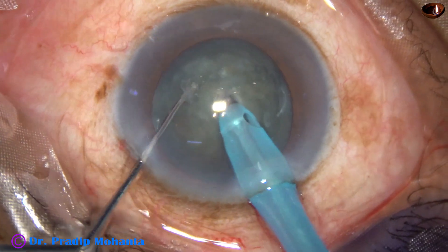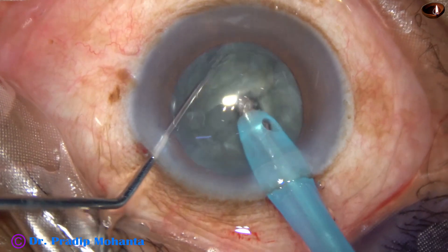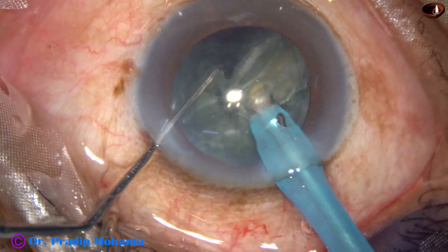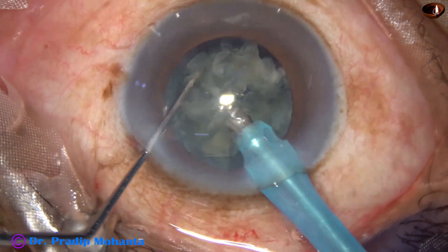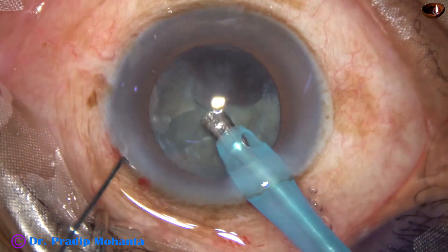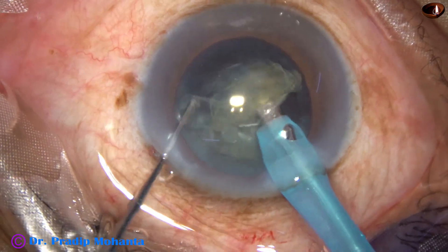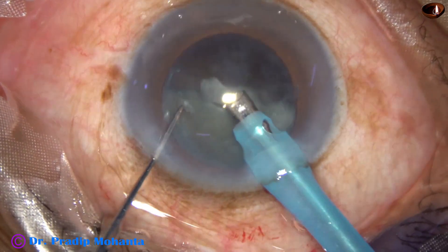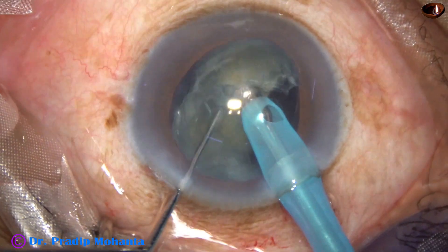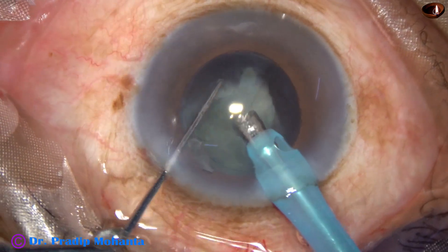The phaco needle is buried into the substance of the nucleus and the nucleus is chopped. The free nuclear fragment is emulsified and eaten off. The other piece of the hemi-nucleus is also quickly emulsified. Then we come to the other hemi-nucleus, chop it into two fragments, and each nuclear fragment is emulsified.